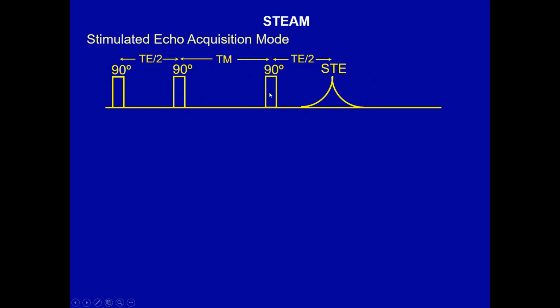And anytime you have 3 pulses, you can make each of them shaped, apply a gradient so that each of them can be made to select a slice in a particular direction, and that could be X, Y, and Z, or Y, Z, and X, whatever order works the best for a particular situation. But you can apply these 3 as shaped pulses with a gradient and get 3D spatial selection.